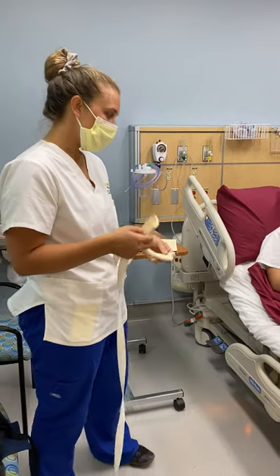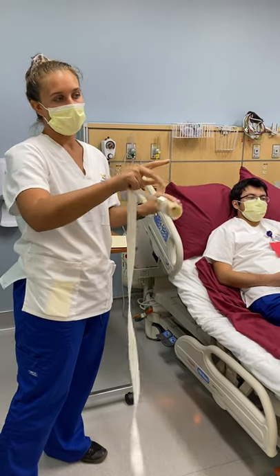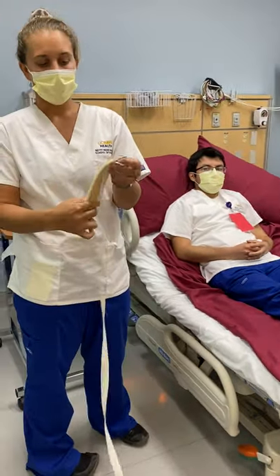Hey guys, so we're just going to show you how to put on a restraint. For the sake of time in this video, we're going to skip through the hand sanitizing and things that we'll go over in a different slide. But for this one, we're just showing this — this is an extremity restraint.